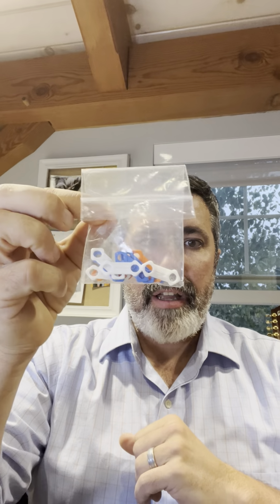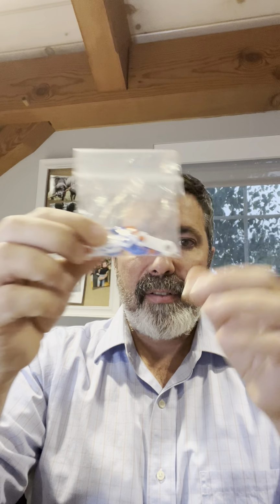So let's start edge to edge, and once the appliance is made, we're going to have the opportunity to titrate using different elastic bands. So if the patient doesn't have the effect that we want, we can switch out the bands every so often until we get that protrusion to where we want it.